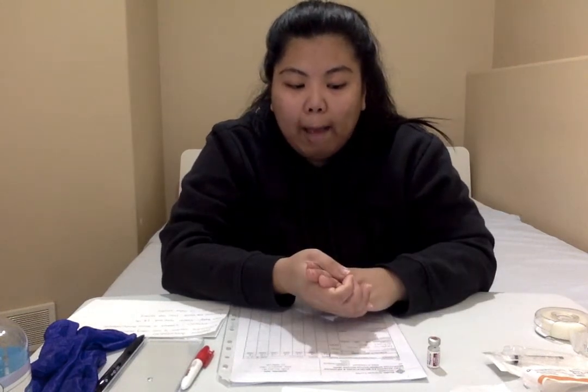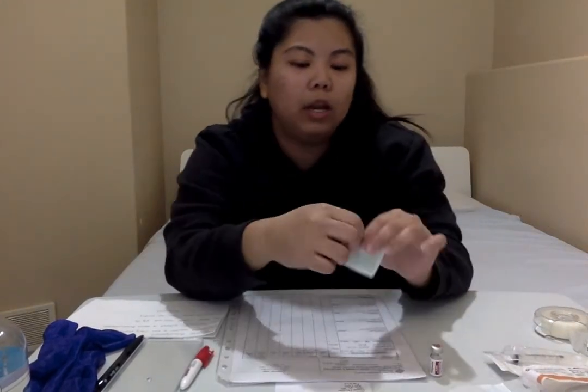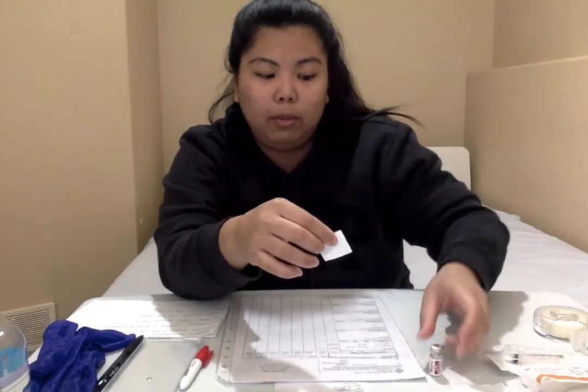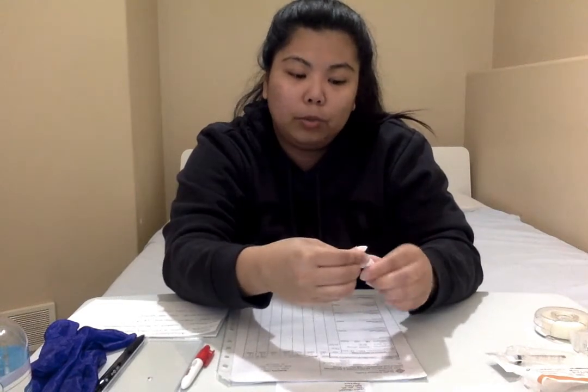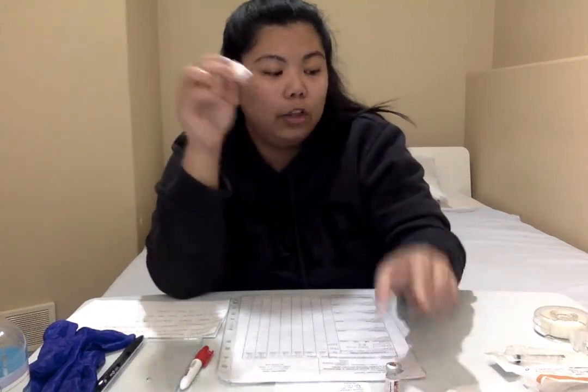Okay. And then, I'm now going to draw up my medication. So I'm going to do hand hygiene. And then this vial here is not brand new, but if I was using a brand new vial, then we would just pop the cap off of this. And then we would clean the rubber seal, the top of the vial, with an alcohol swab. And we want to wipe for a good 30 seconds just to make sure that it's really clean. And then before we draw up our medication, we want to make sure that it's dry. So let's pretend that I've wiped it down for a good 30 seconds.